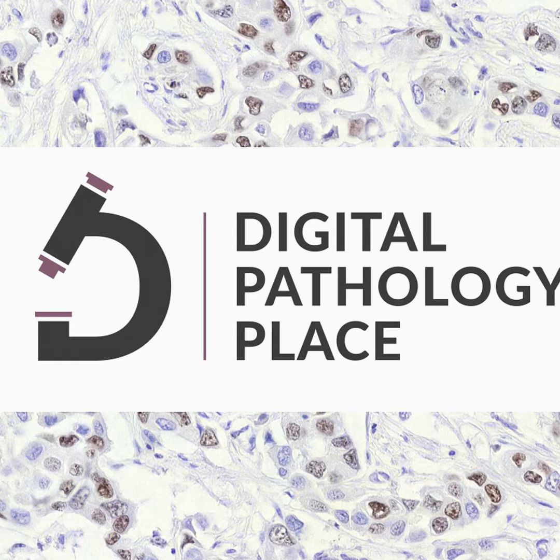And now we have this HistoLite, a lightweight self-supervised learning framework designed to enable domain-invariant representation learning in histopathology. This domain discussion is like, okay, if you know that you're going to have slides from different places and images from different places, you want to make a model generalizable. So you want to make it kind of immune or resistant to domain shift.